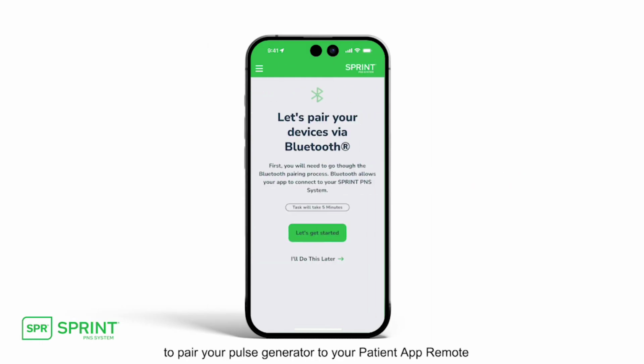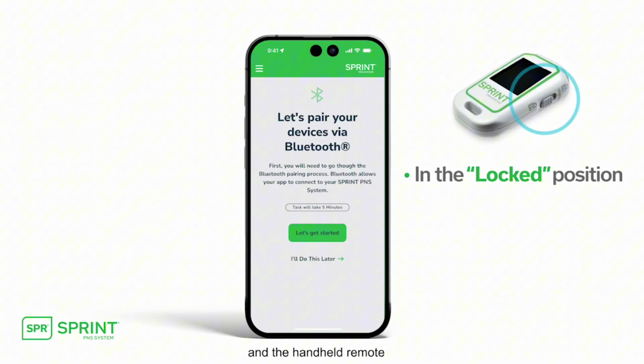To pair your pulse generator to your patient app remote, you will need to go through the Bluetooth pairing process using these steps. If you do not pair to your pulse generator, you will be able to view the educational content within the app, but will not be able to control your pulse generator using the patient app remote. Go to your patient app remote. Note that your pulse generator can only be paired to one phone at a time, and the handheld remote needs to be in the lock position.